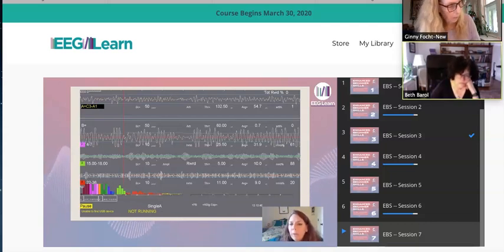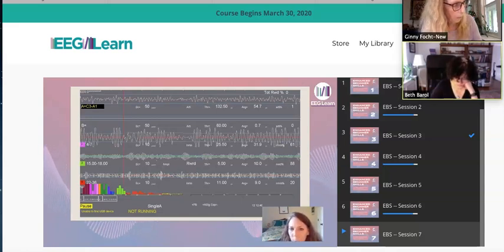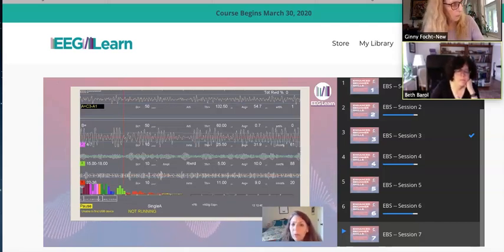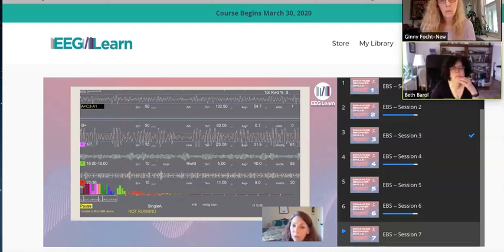So if their average amplitude is coming in at 9, I'm going to give them a little wiggle room, and I'm going to treat this like a ceiling. I really don't want that fast frequency beta to get up into the double digits, because that would probably mean the person was tensing up and trying really hard. So that's why I set that threshold at around 11 microvolts.